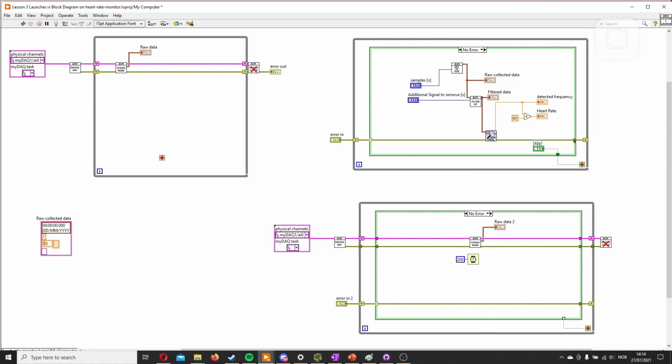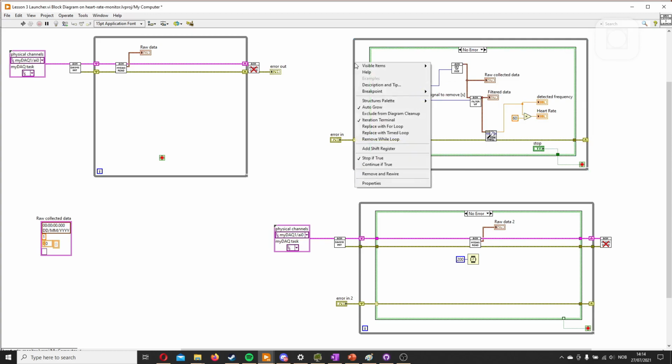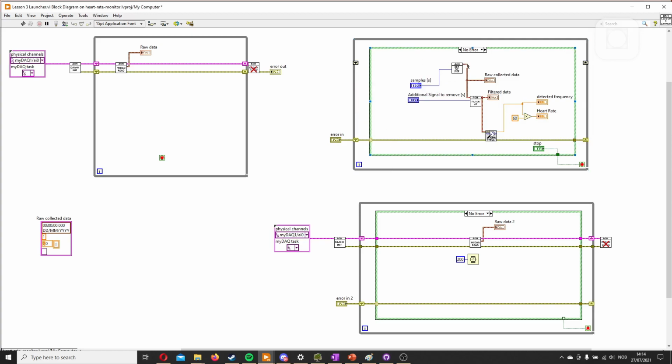If there's ever an error here, it will go in here, the shift register will take it there. Instead of choosing the non-error case, it will go to the error case where it will stop. There we go. We also need a shift register for this waveform.